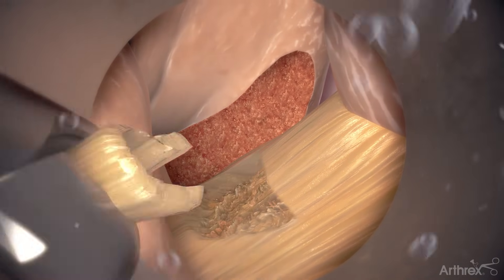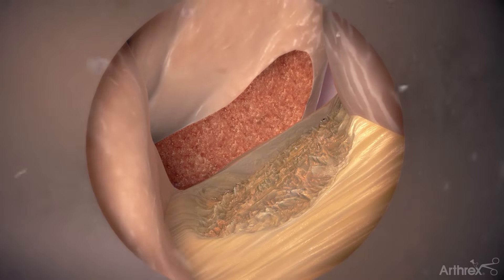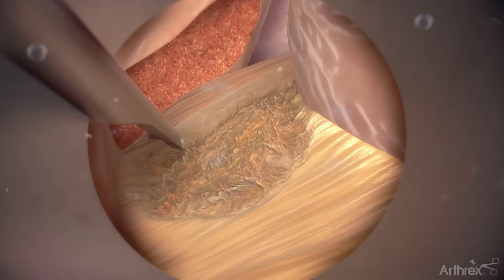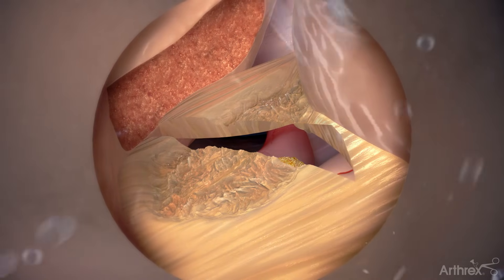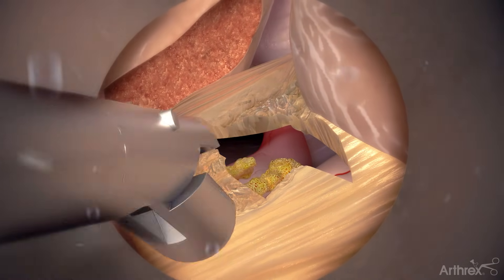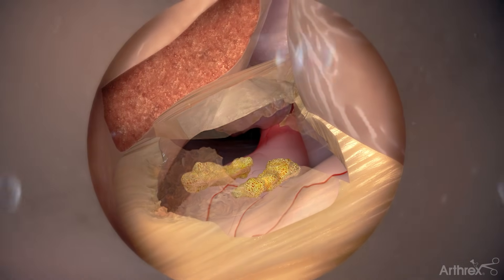Use forceps to reach the deep layers of the ligamentum flavum. Then use an elevator to split the ligamentum flavum in a craniocaudal direction to access the epidural space. Remove the ligamentum flavum using forceps and Kerrison rongeurs.